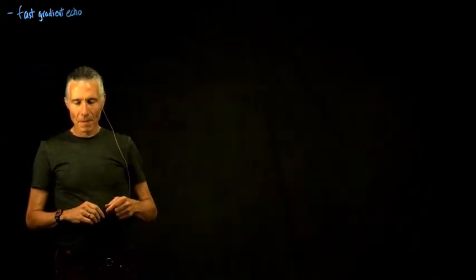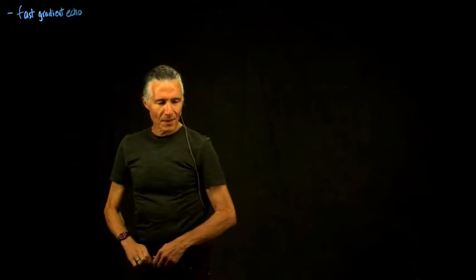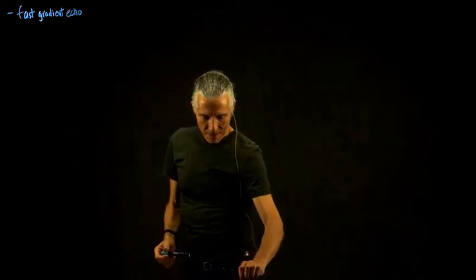We used that last one that I talked about, that T2 turbo spin echo, 3D turbo spin echo sometimes, but the ones I'm going to talk about this week are literally sort of take up 90% of the scanner. So they're generally called fast gradient echo, and just to put that into context, we should mention what slow gradient echo is.